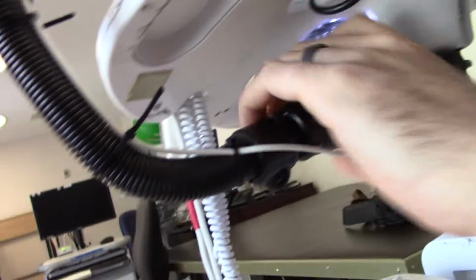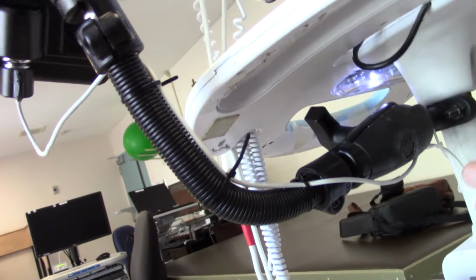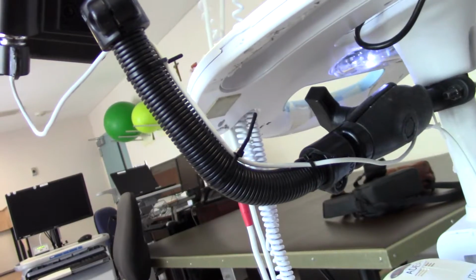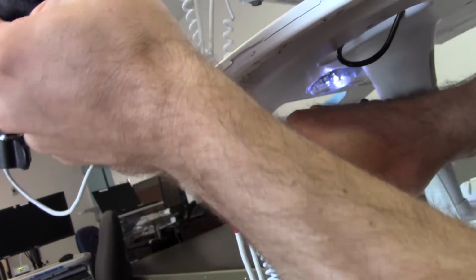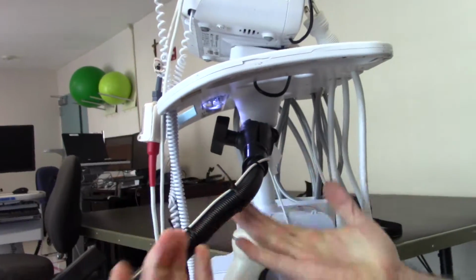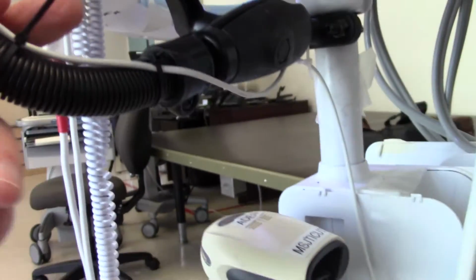Correct. So this part here is an aluminum rod. This rod is actually 18 inches long when it's ordered. Our biomedical department cuts it down to size. And do they shape it too? Yeah, it's a bendable rod. It's a flexible piece of aluminum, and so you can bend it to whatever shape you need. So they cut it down in size from the original.